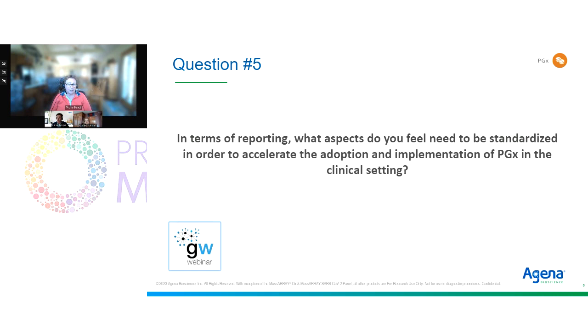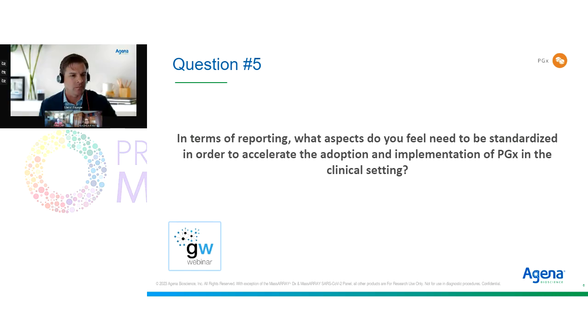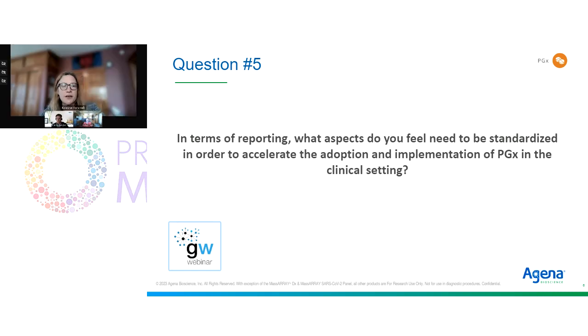Kristine, thoughts here as well? Any addition? Again, I know we've touched on this throughout the course of the questions, but anything else come to mind here? As I said earlier, the AMP Tier 1 at a minimum. I know that Access DX, our associated lab with YouScript, also has all the AMP Tier 2. And certainly include them if you're capable, right? We want to continue expanding that information.